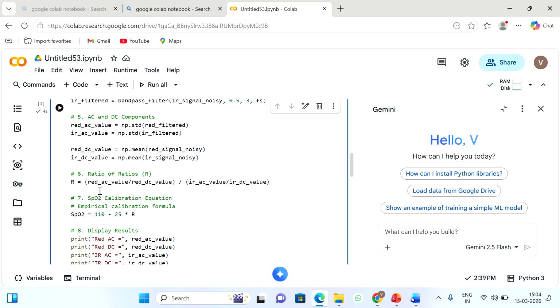Now the ratio of ratios, how is it calculated? The value is represented in terms of R. R is equal to the AC component of the red signal divided by the DC component of the red signal, the whole divided by the AC component of the IR signal divided by the DC component of the IR signal. Finally, from the R value we have to calculate the SpO2, which is the oxygen saturation of the blood, the percentage of saturated oxygen present in the blood. For this we have one standard calibration formula: SpO2 is equal to 110 minus 25 into R. R we have already determined.